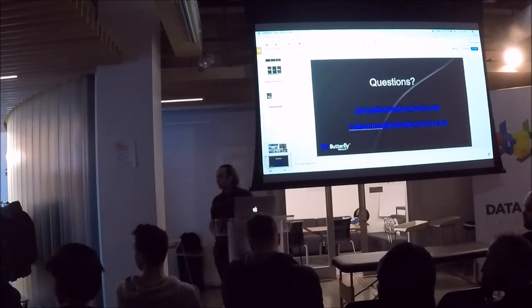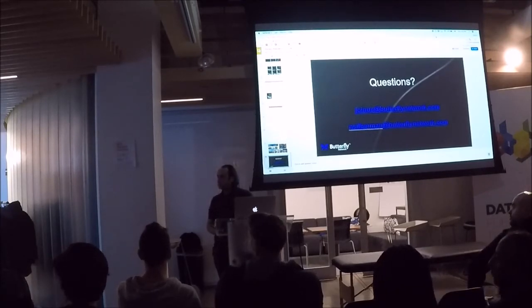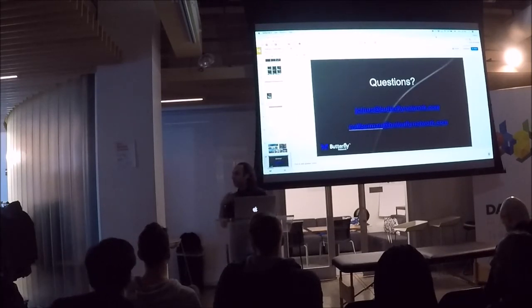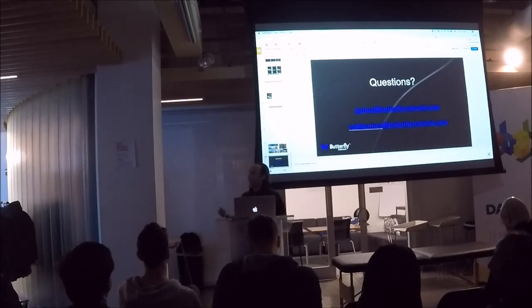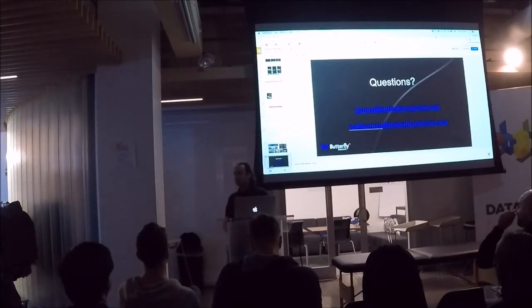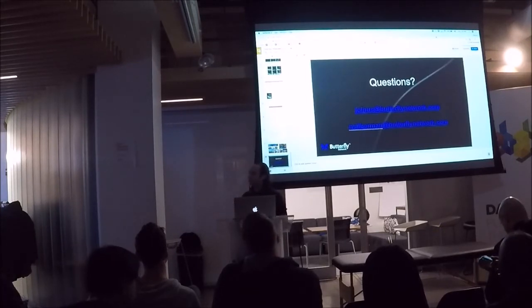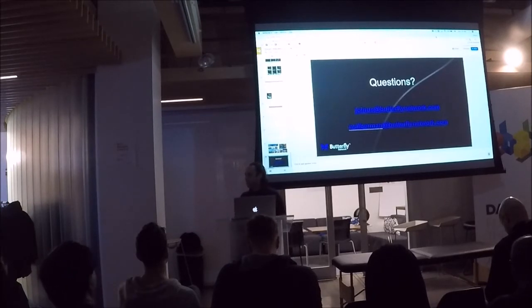That 92% score you showed, how does that compare with, say, a $25,000 machine? Yeah, so that 92% score is our own quality metric, which is our own indicator of how reliable that number, the ejection fraction, is. We haven't done side-by-sides taking images or captures from other ultrasound systems. All the calibration has been done using images from our device.